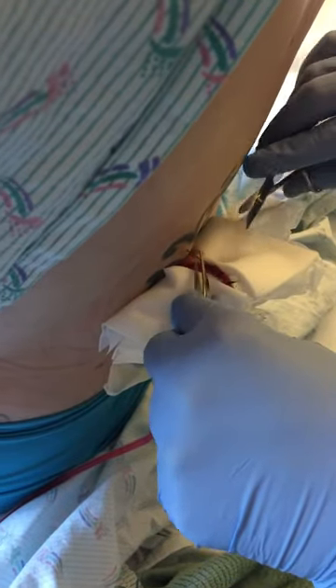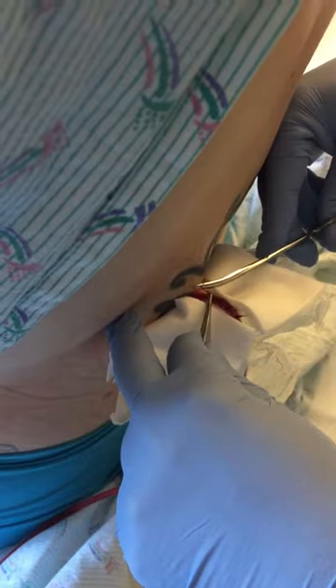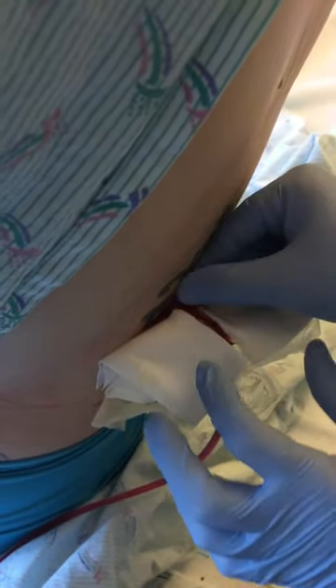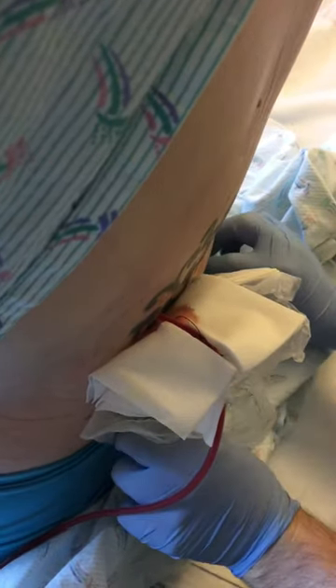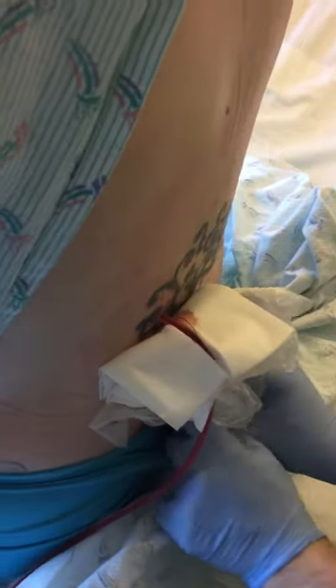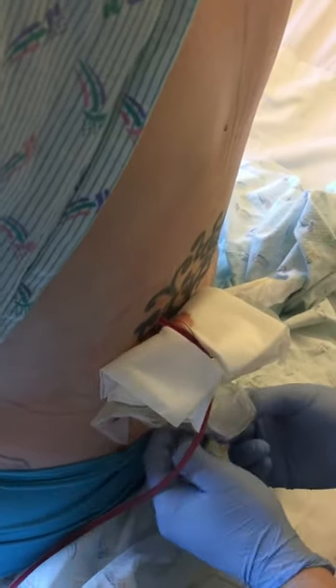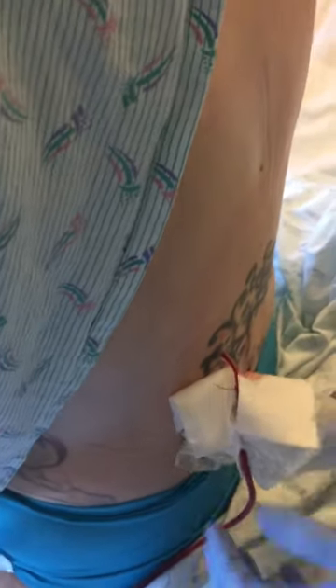So one of the things you want to do is just pull this a little bit out of the skin. I know that's tender — the reason is I don't want to drag that suture back through your back. Sorry, I gotta go a little bit lower here. This is just to get the edge of the dressing, which was sitting right below the edge there. Once we get all this — yeah, that looks pretty fantastic.